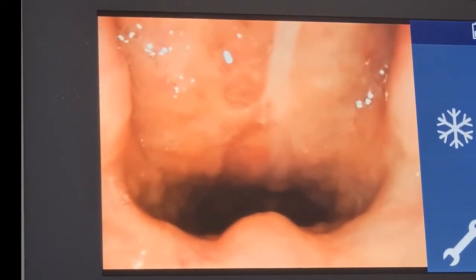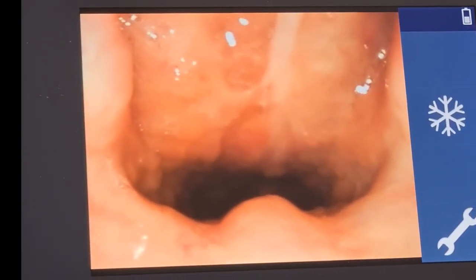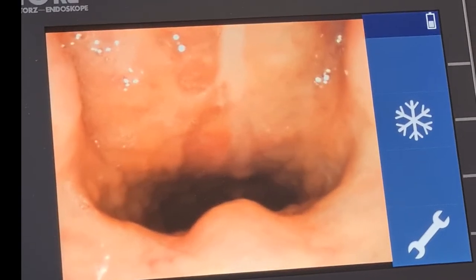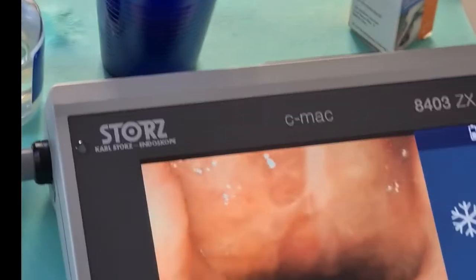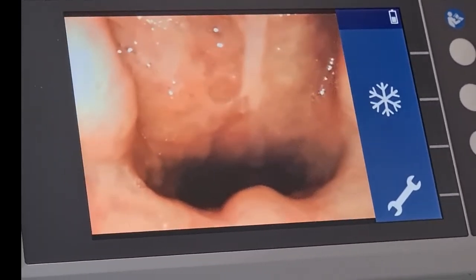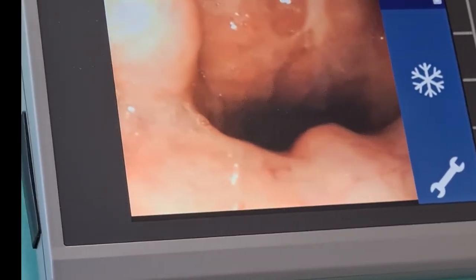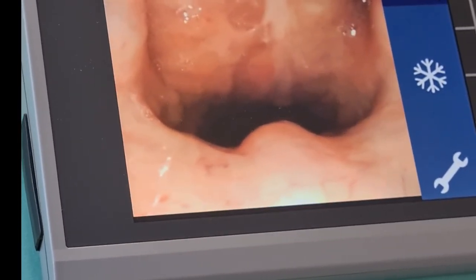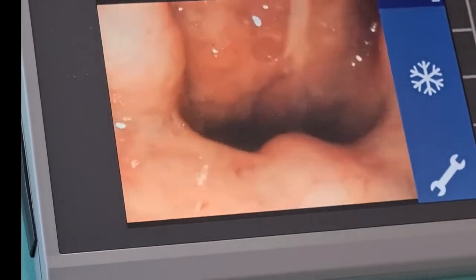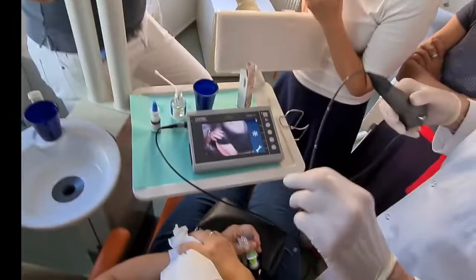And doctor, if she was lying back, would it be different? Of course. To move the chair back? The chair cannot be moved. I would like to do it, but unfortunately this chair has a vertical position. So it is important to have the vertical check and the horizontal check. Now, we could move to another chair. You've had enough?